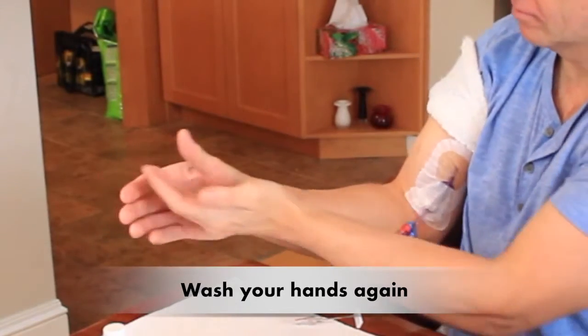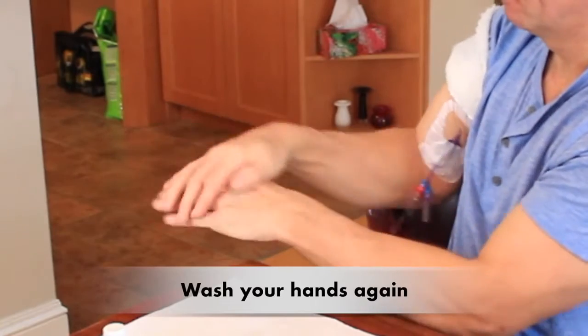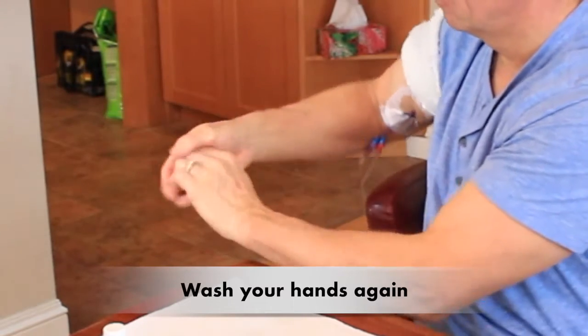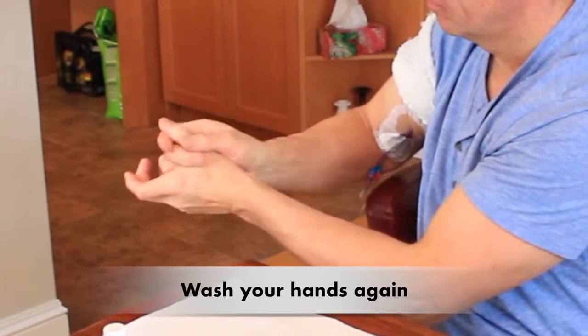You need to wash the palms of your hands, the tops of your hands, in between your fingers, your thumbs, your fingertips, and your wrist areas. If you're using hand sanitizer, keep cleaning, scrubbing until your hands are dry.